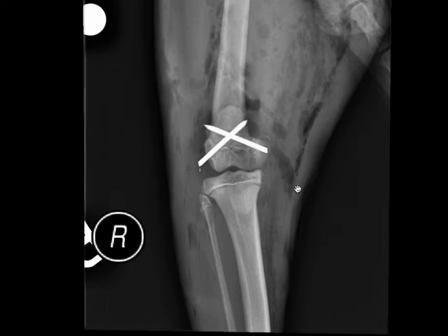The implants that have been placed to reduce this fracture, although they've brought it into good alignment, you can see that the amount of the metaphysis that's engaged with each of these implants is fairly small. The implants are also engaging at a very sharp angle, which can cause difficulty with ongoing growth at the physis. So it's very good that these implants don't enter the joint. We can see that the femoral condyles do not have implants, and that can be a really tricky thing when trying to drive an implant across these distal femoral fractures.